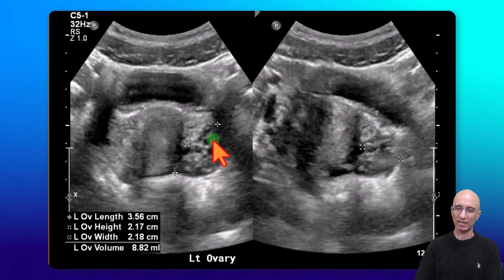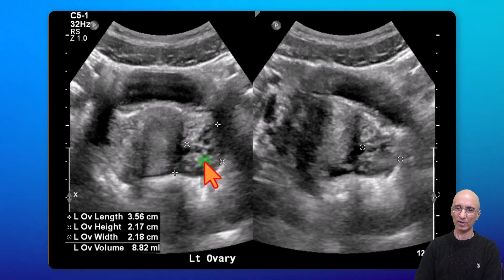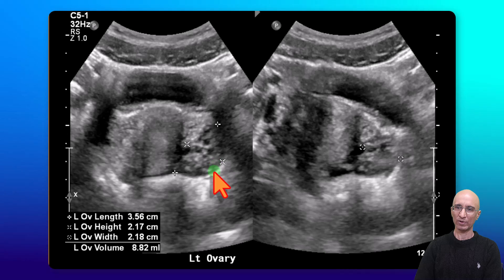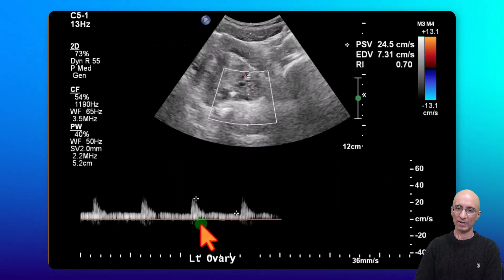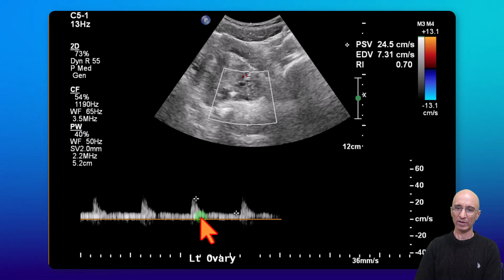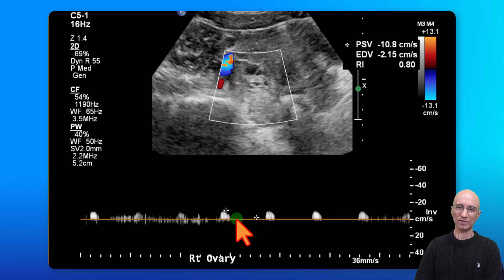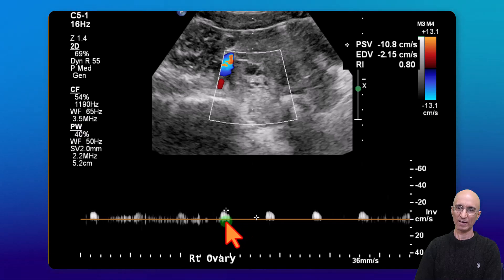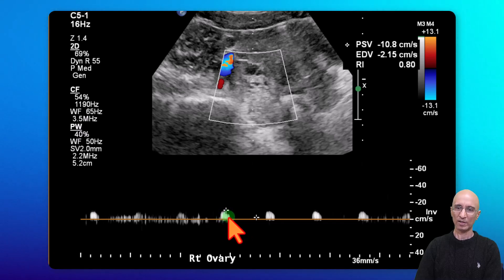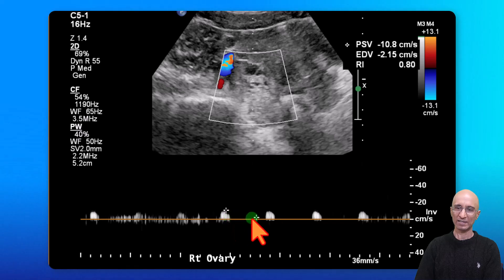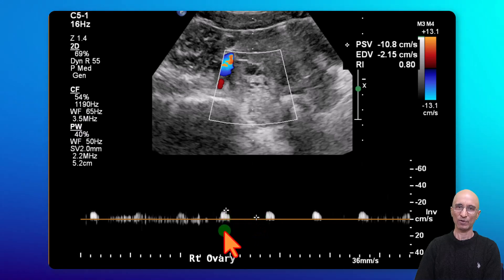In contrast, the left ovary appears normal in size. We can see some follicles scattered throughout the left ovary, and we have a nice low-resistance arterial waveform in the left ovary with a sharp upstroke and preserved diastolic flow. Contrast this to the flow in the right ovary, where there is a small amount of arterial flow which appears to be high resistance without any diastolic flow.